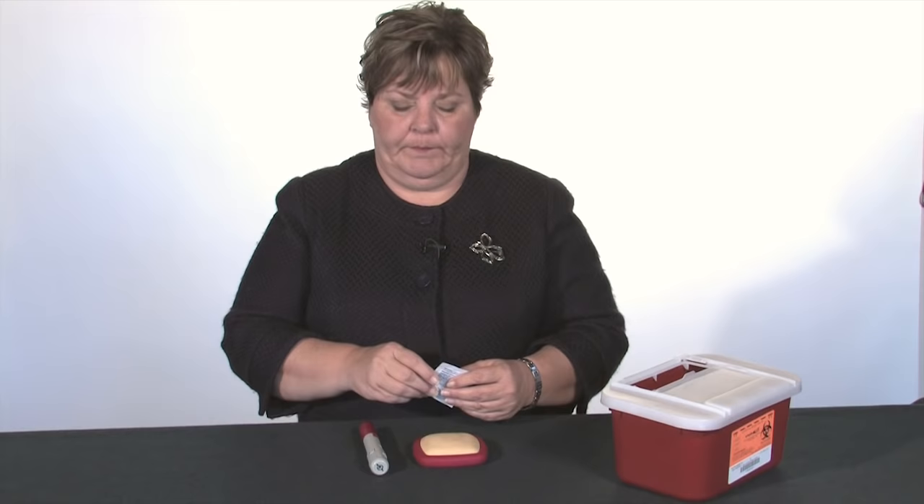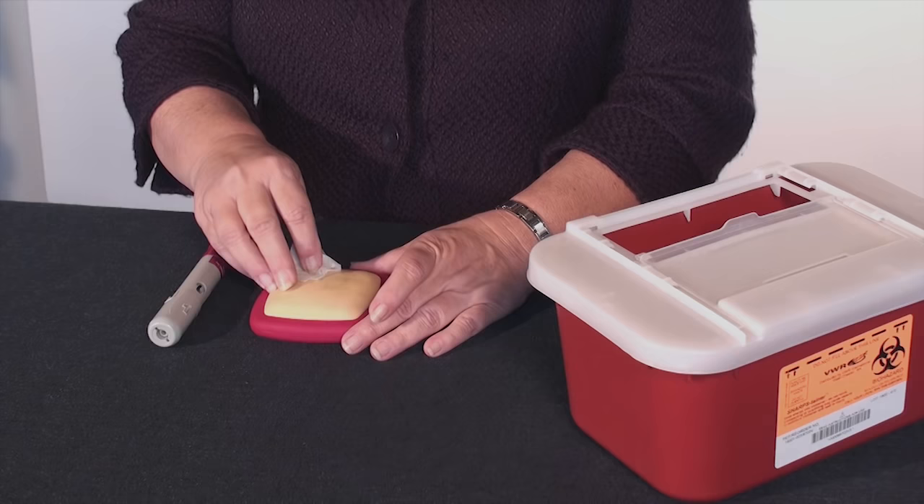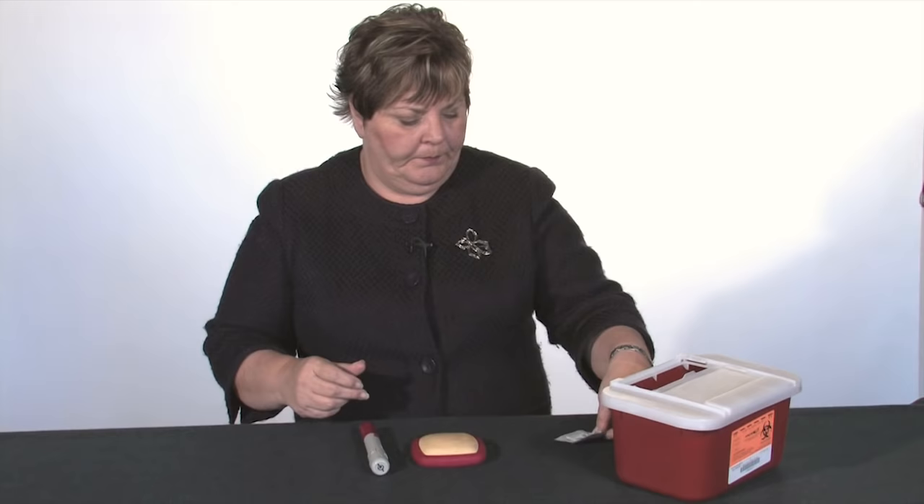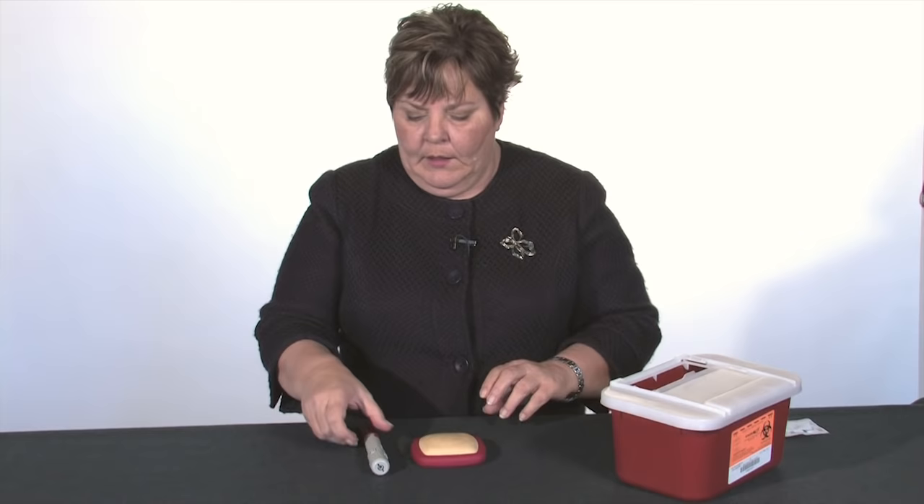The next thing you're going to do is prepare the skin. The areas to use for injection are areas where you have a layer of fat. The area between skin and muscle is called the subcutaneous layer, and the places on our bodies where fat is stored are generally the outsides of the thighs or the stomach. Prepare your skin by vigorously cleaning with alcohol the area for about 20 seconds, and then let that dry.